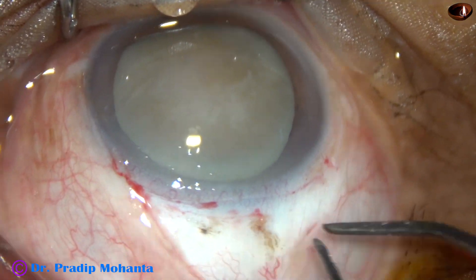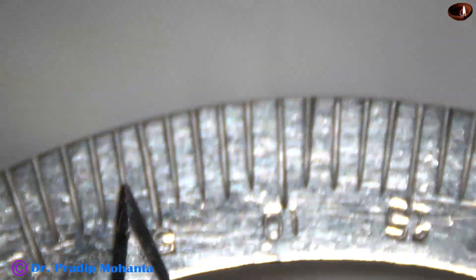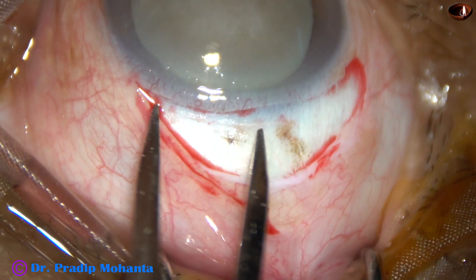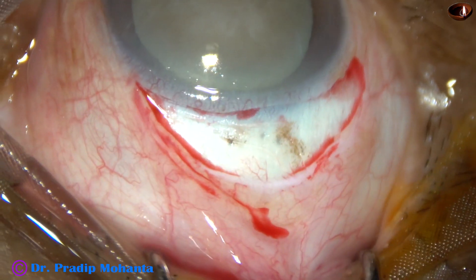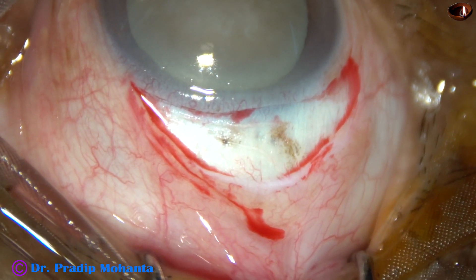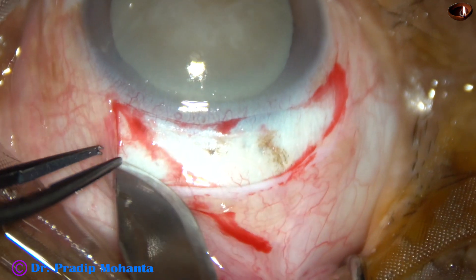Very mild, wet-field cautery has been done. And now I am going to make 2 incisions — 2 SICS incisions, 5 mm each. This is 5 mm, and this is also 5 mm. These 2 clock hours are going to be placed side-by-side — 2 SICS incisions placed side-by-side.